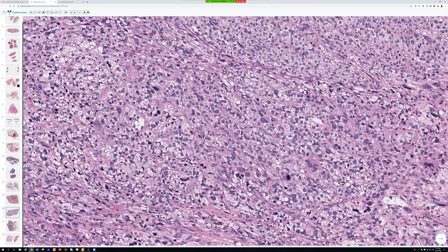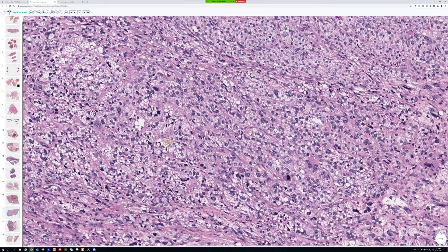But this doesn't look anything like undifferentiated pleomorphic sarcoma. This looks like adrenocortical carcinoma or something. It would be unusual to have a 10-centimeter thigh mass that was metastatic adrenocortical carcinoma in a patient with no known primary — that would be strange.